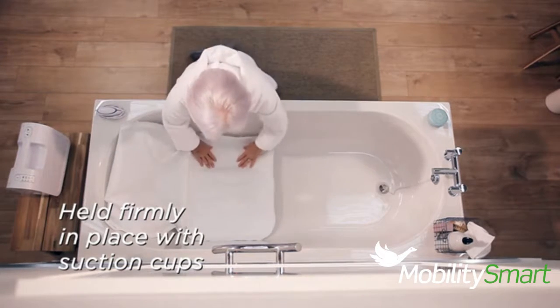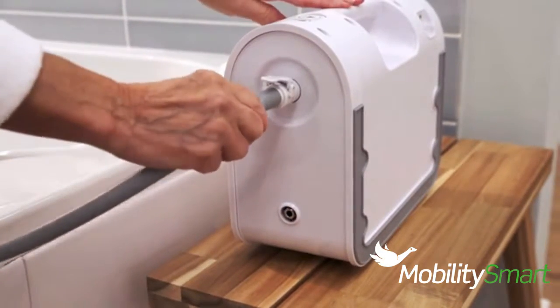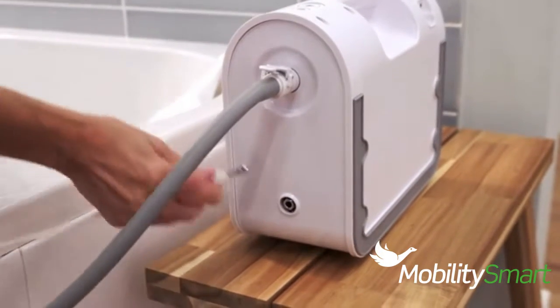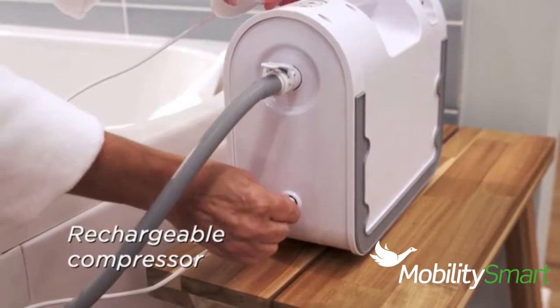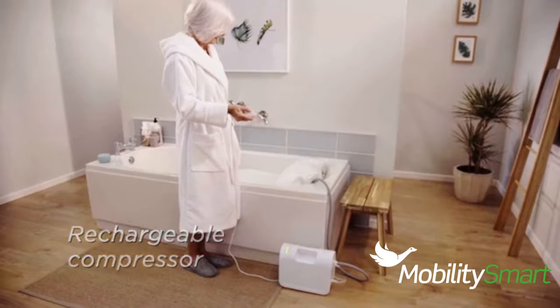Simply lay it out in your bath and four suction pads hold it firmly in place. It's so easy to connect the hose and handset to the airflow compressor, plus the compressor is rechargeable, so no electrical cables are needed in the bathroom.